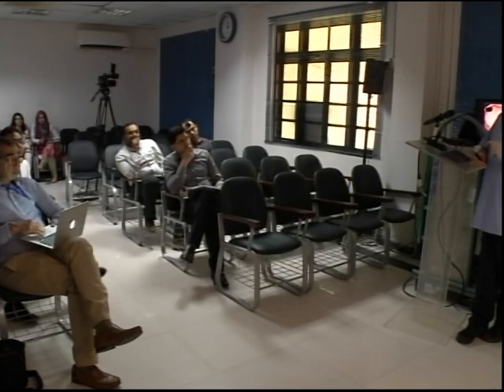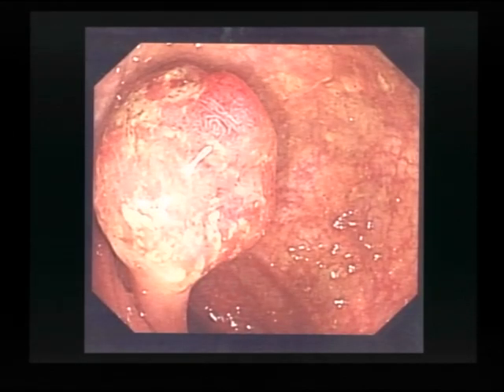So already we're looking at accessibility. It's over 1 fold, 3 centimetres. Have you got a big enough snare? So we're looking at 7 points already. It was in the sigmoid, so it was 1 point. The scoring system aligns itself against someone's skill set.